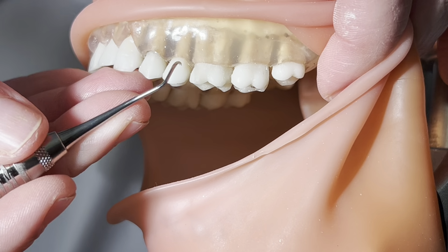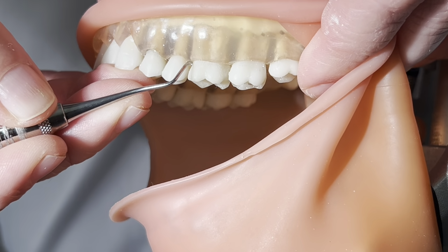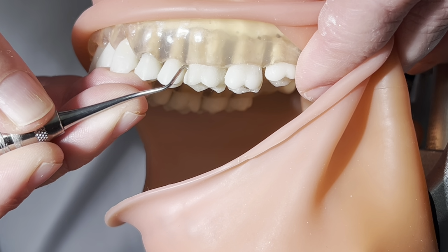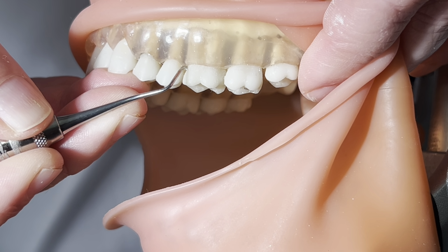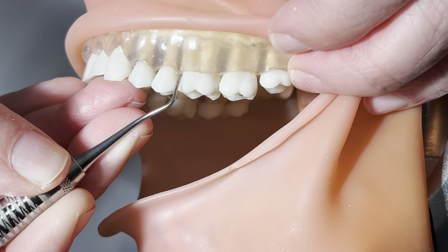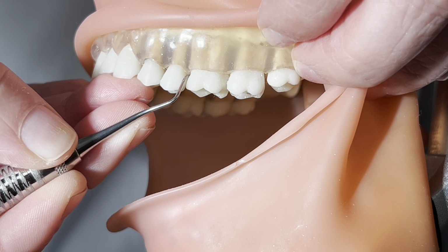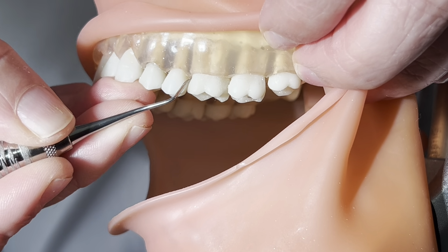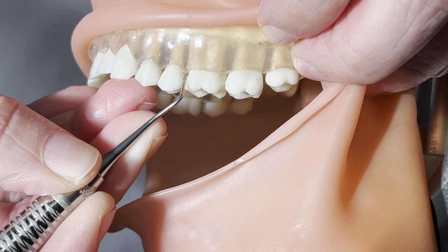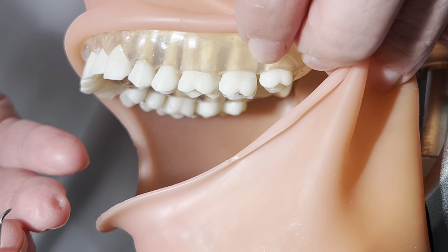Looking at the mesial surface, it looks very similar. So starting again at 90 degrees, and to get to 70 to 80, you can watch the heel is going to come closer to the tooth. You can also see the handle's going to come up when you get the correct angulation. So 90, 70 to 80 degrees, which is correct for this surface.